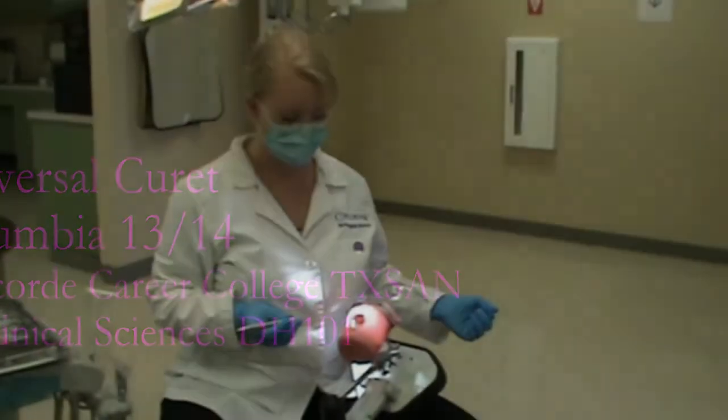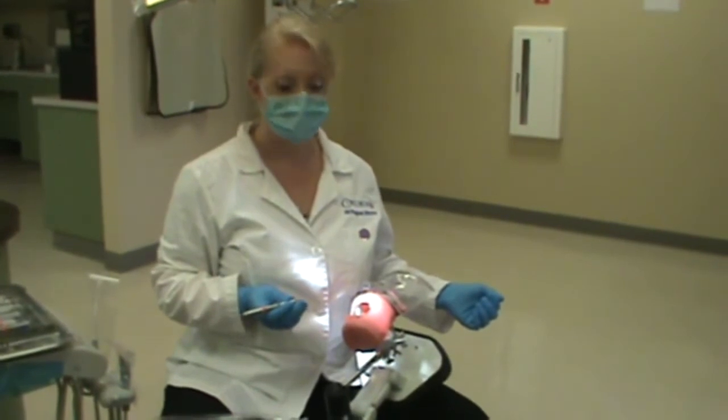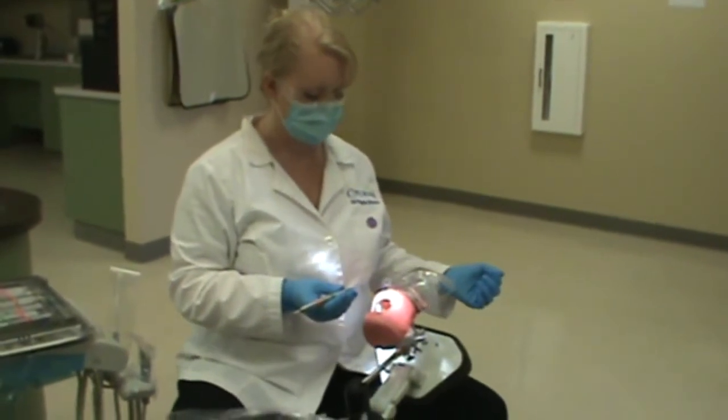Ms. McFell will be scaling the facial surface of tooth number 14 with the Columbia 1314 Universal Curette. Since she is a right-handed clinician, she has positioned herself at the 9 o'clock.